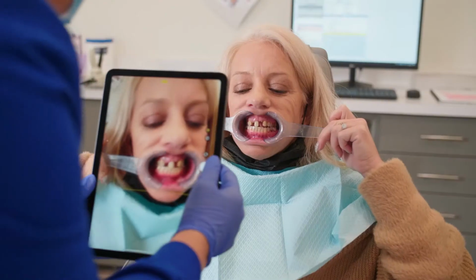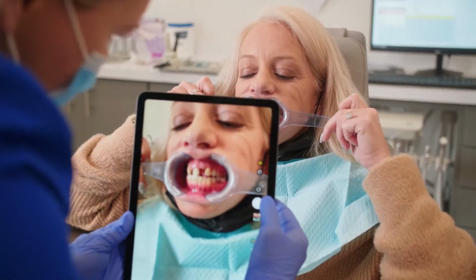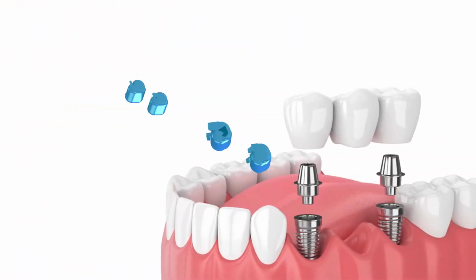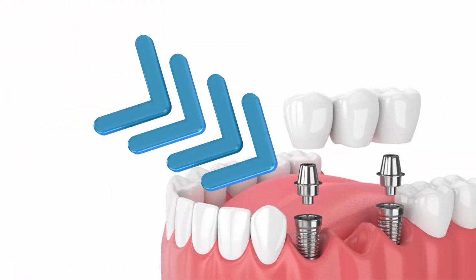The second type of situation in which implants can be used to rehabilitate a patient's dentition is when you have multiple missing teeth, but the remaining teeth that are in the mouth are in healthy condition periodontally, and they don't need much restorative work. In those situations, we can place 2 or 3 implants and make implant bridges to replace those missing spaces.